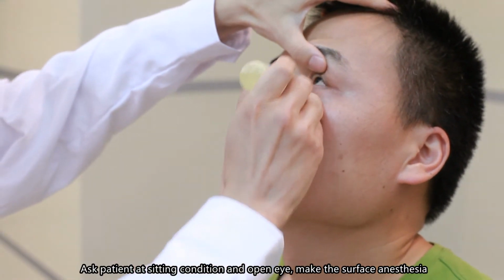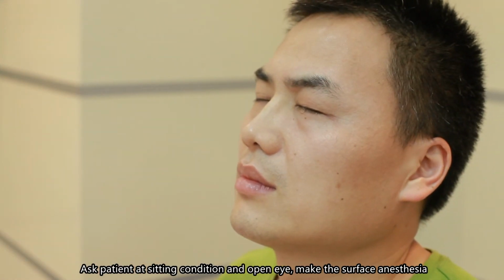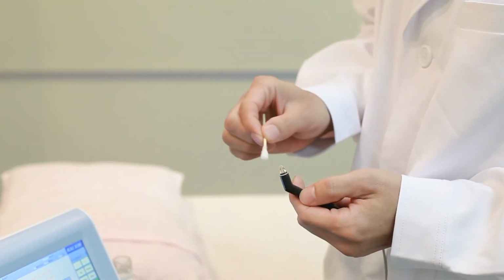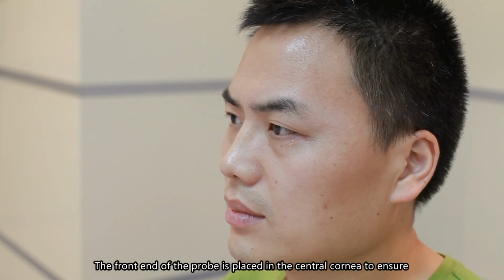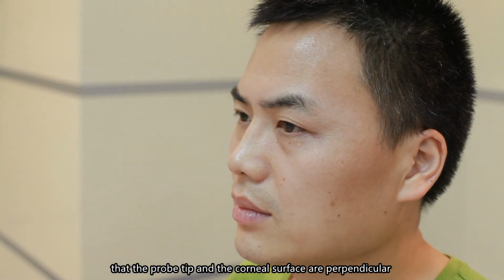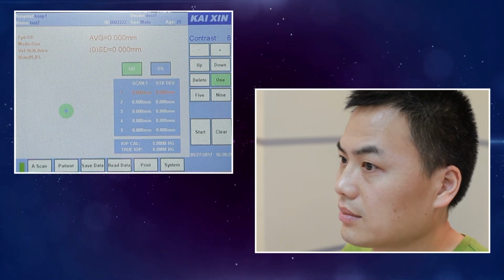Ask patient at a sitting condition and open eye. Make the surface anesthesia. Disinfect the pachy probe with medical alcohol. The front end of the probe is placed in the central cornea to ensure that the probe tip and the corneal surface are perpendicular. Click Start button to start the measurement.